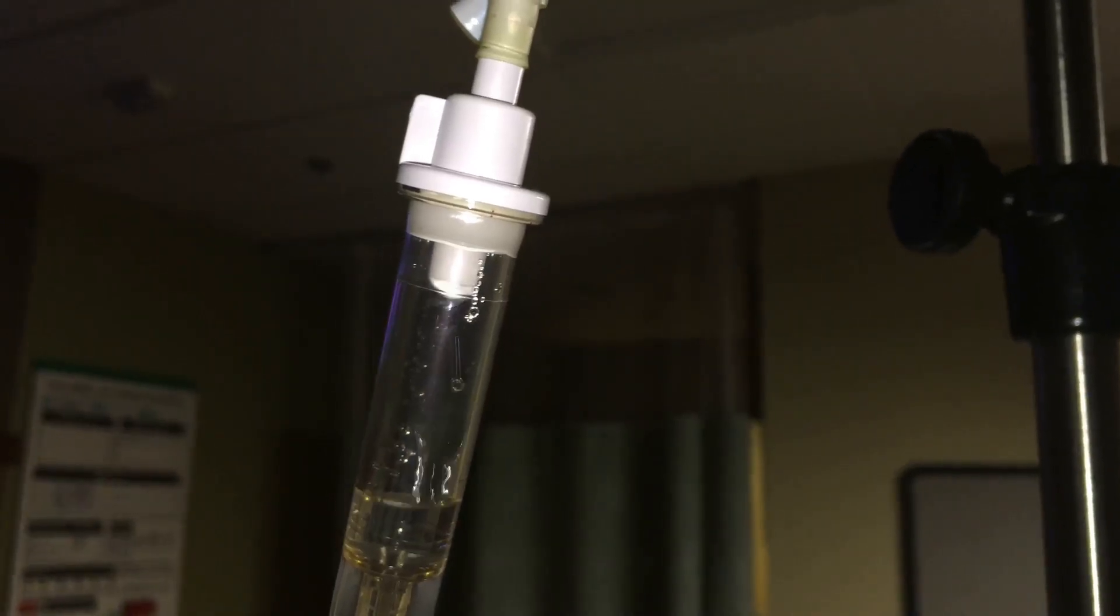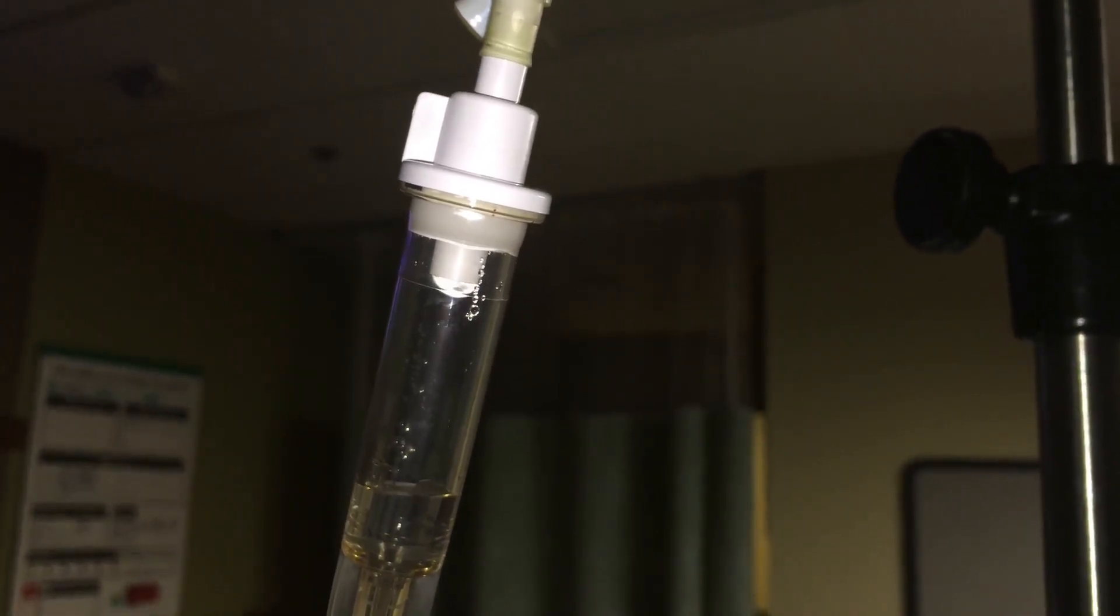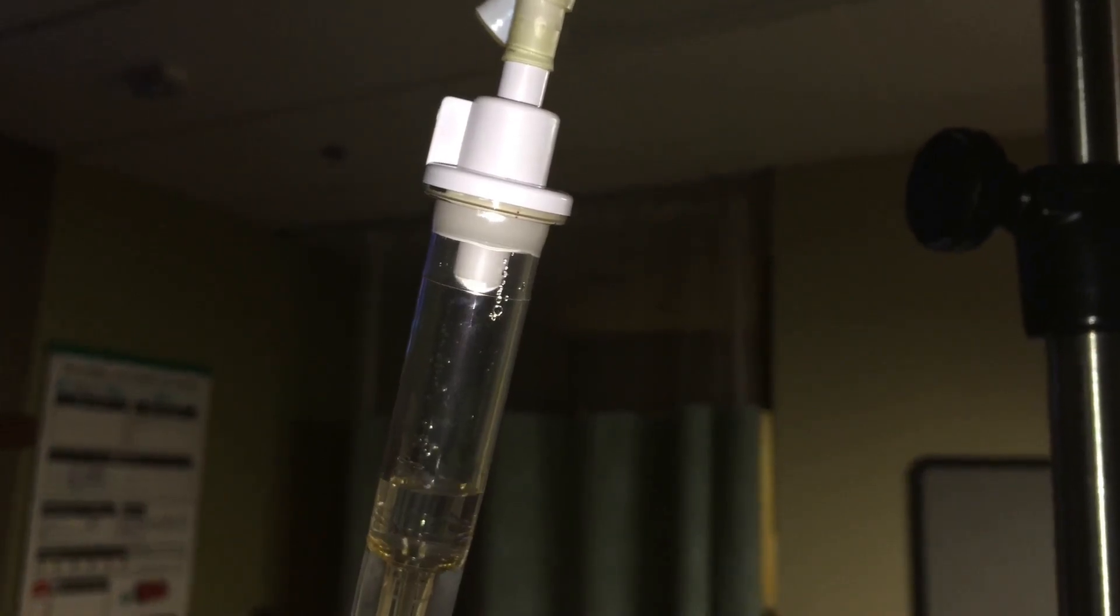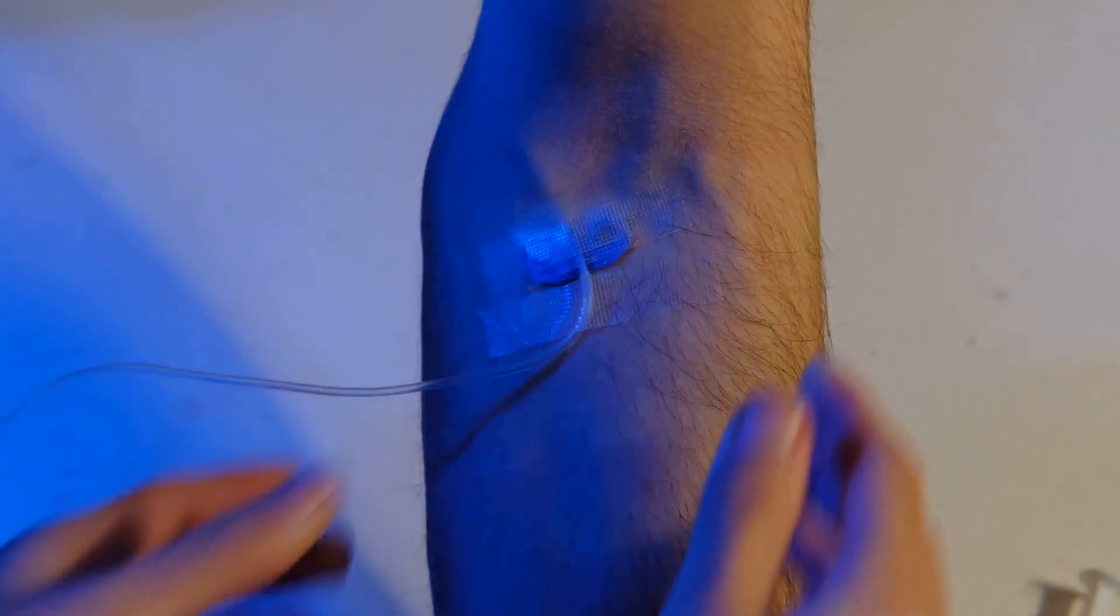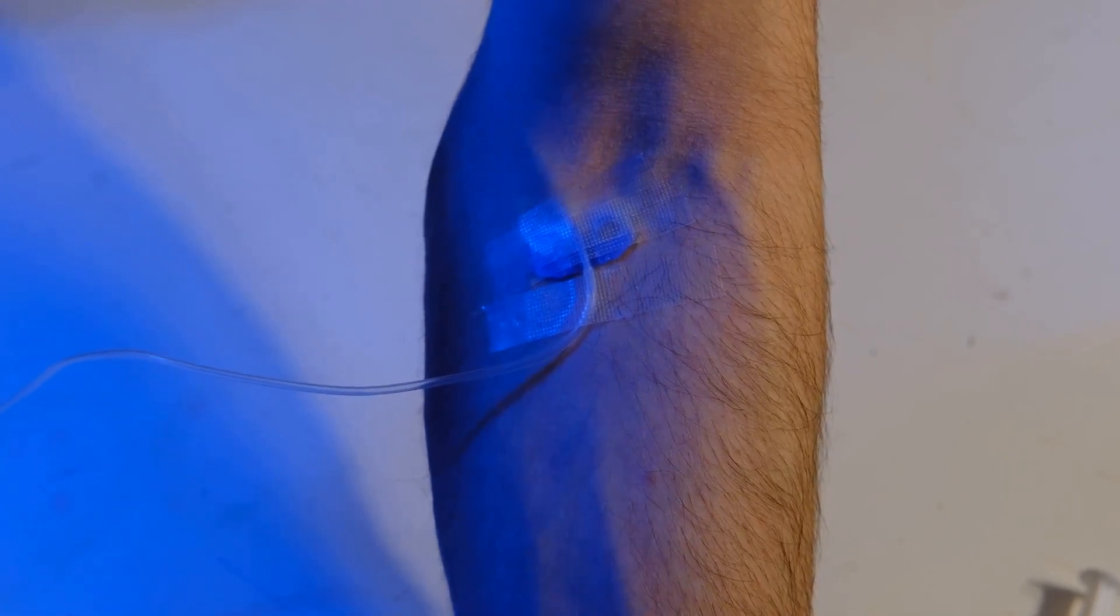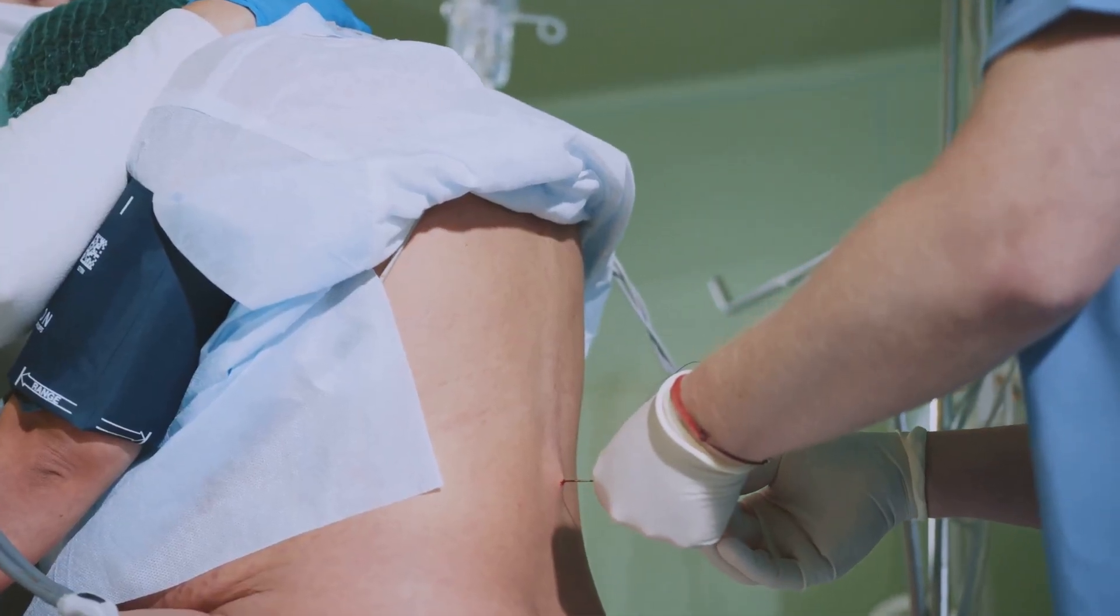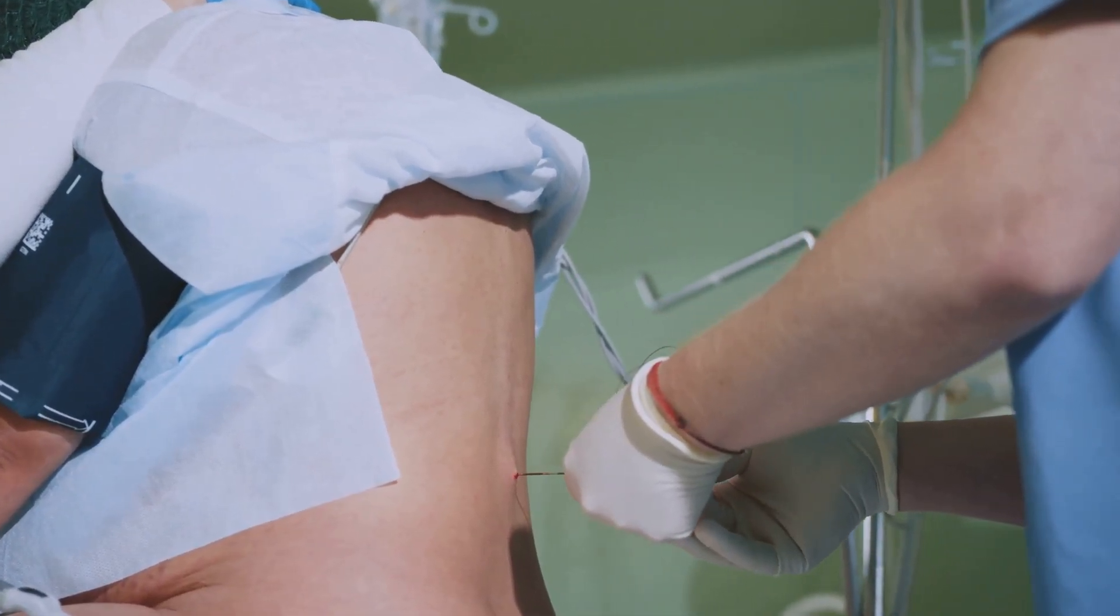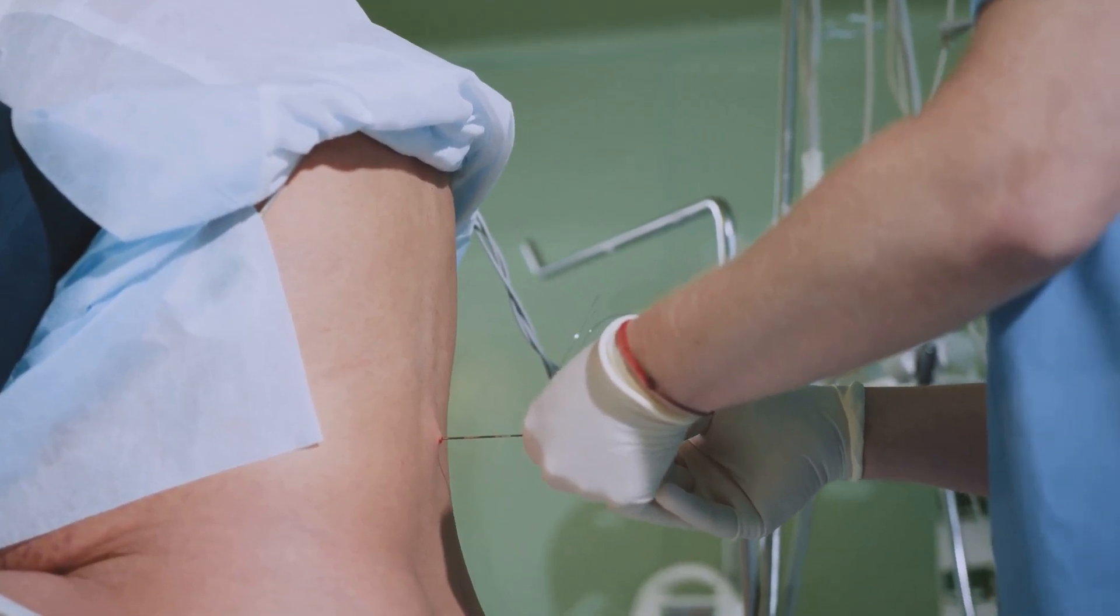Infiltration occurs when the cannula tip comes out of the vein and fluid leaks into the surrounding tissue, which can be uncomfortable and even harmful if not addressed quickly. You'll notice swelling, coolness and discomfort at the site. The area may also look pale or feel firm to the touch, and the patient might report a stinging sensation. Stop the infusion immediately. Remove the cannula and apply a warm compress to help the body absorb the leaked fluid and reduce discomfort.